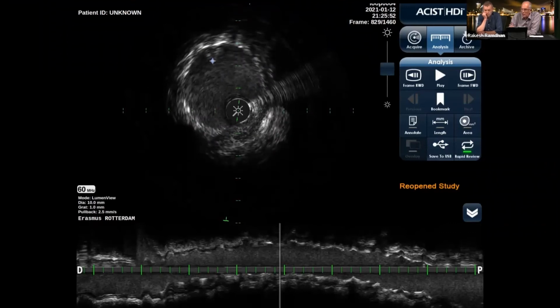There is a difference with tissue protrusion. Sometimes soft tissue can also protrude through your stent struts, and then you will find the protrusion only between two stent struts. Thrombus tends to dig your stent struts into the thrombus, like here. It's over a couple of stent struts. It comes from behind the stent.